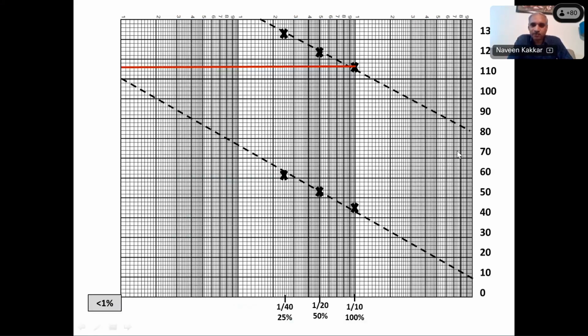So if you notice, the gradations are not similar, right? So this is a semi-log paper. The normal kinetics of coagulation is curvilinear. So if you plot normal times of clotting, they are like this. On a semi-log paper, the times are converted to a straight line, which is easy to assess. So that is why we use what is called a semi-log paper.